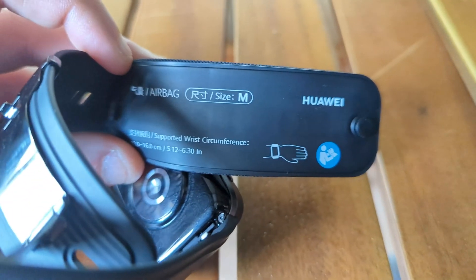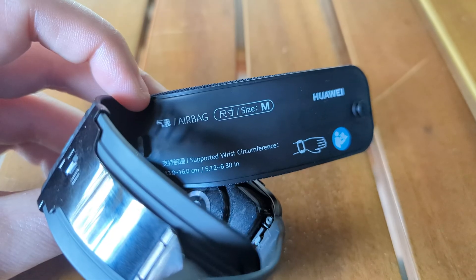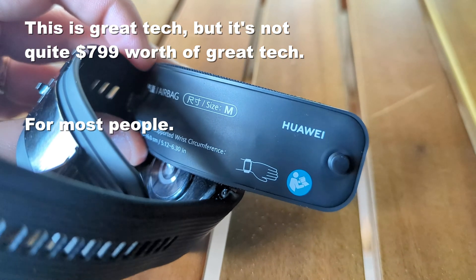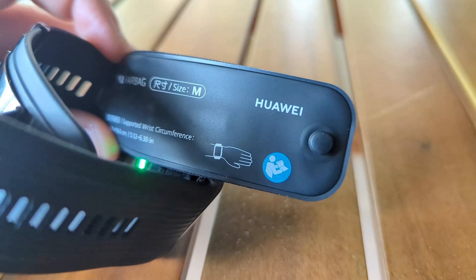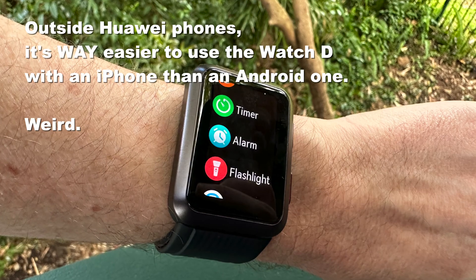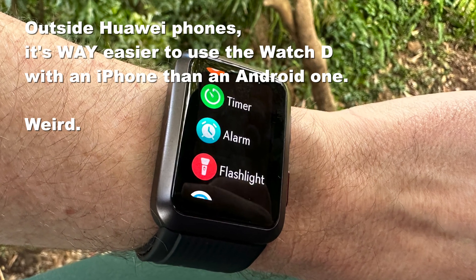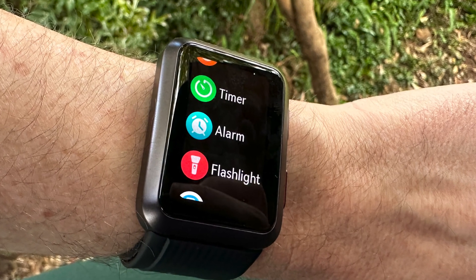But is admirable the same thing as 'here's a product you should buy'? Sadly, I think the answer for most people is no. There are a couple of challenges when setting this device up. If you're on a non-Huawei Android device, you're going to have to sideload Huawei's app gallery, which is a bit of a mess, and then load Huawei Health in order to sync to it. Whereas on iPhone, you just install Huawei Health off the App Store. Obviously you have to decide about trusting medical data, but that's a decision you've presumably already made if you've bought the Watch D.